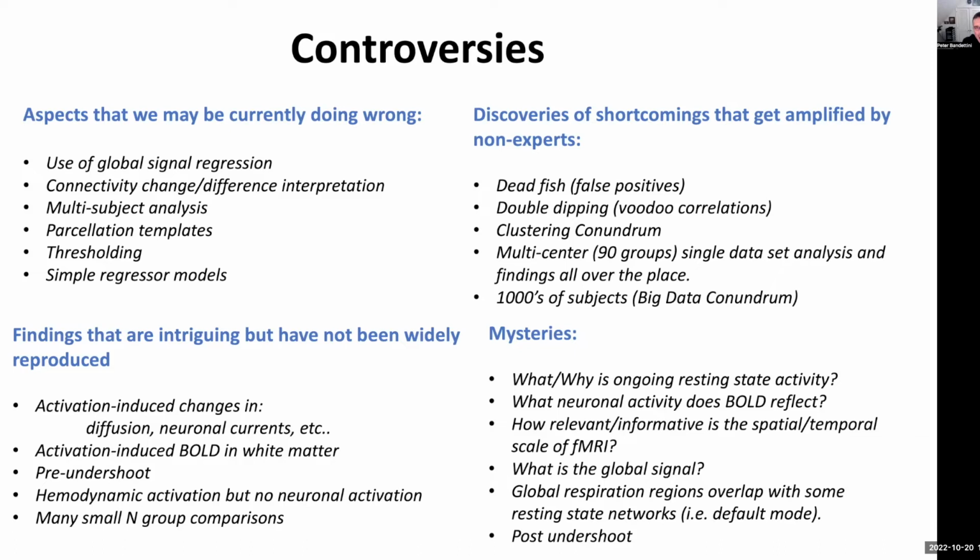And I think it has a lot to do with how we're not embracing and adapting to individual subject differences and all the dimensions of how they could be different. So doing multi-subject analysis by pooling templates, like a single template parcellation, and then using that as the template might be throwing out a lot of sensitivity. And that goes into parcellation templates.